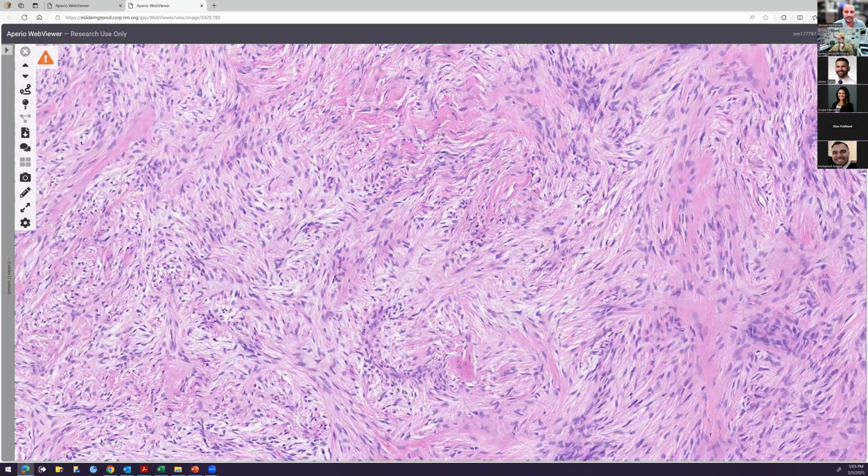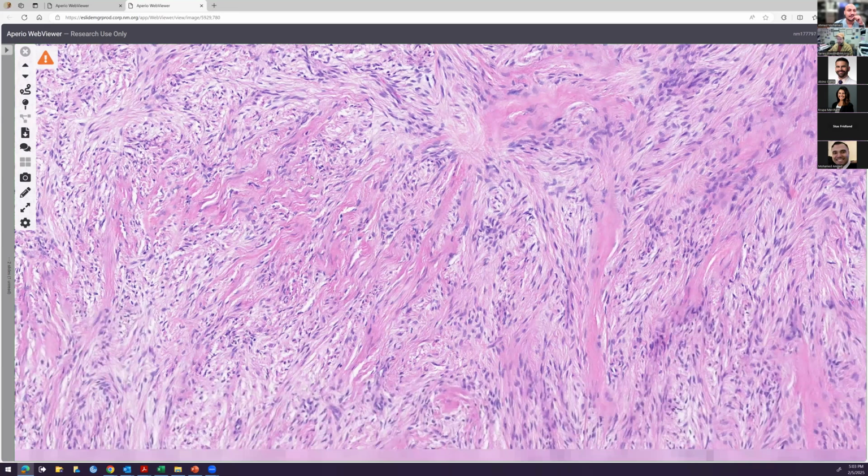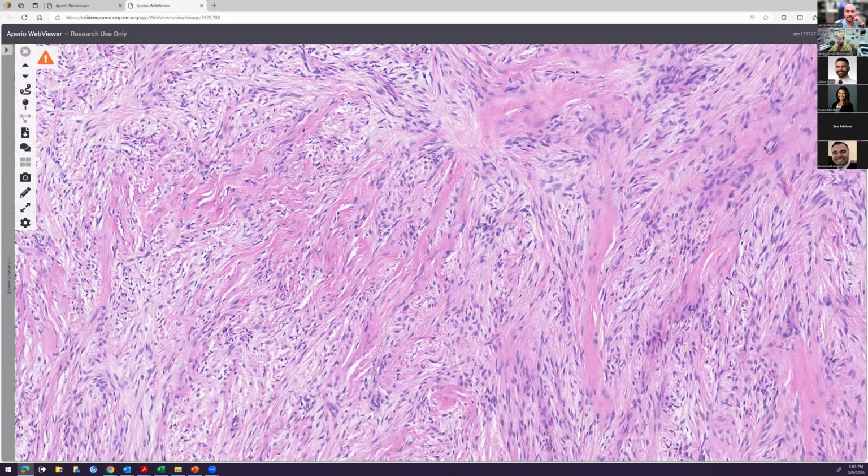Here's another one of these vessels, these little curving vessels. With a myxoid background and a lot of blood vessels, I can think of something like angiomyxoma, but this lesion is infiltrative. Angiomyxoma. All right, you can be a bit more specific there, because there's superficial angiomyxoma and aggressive angiomyxoma. Certainly could consider something like that. What's the reason it's probably not that?